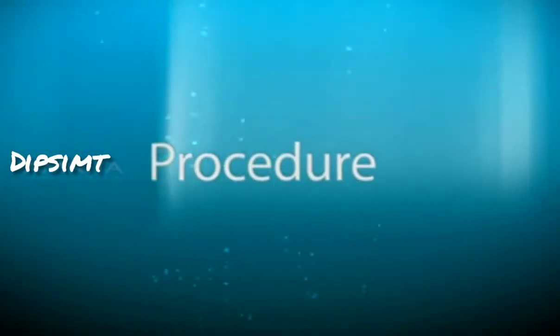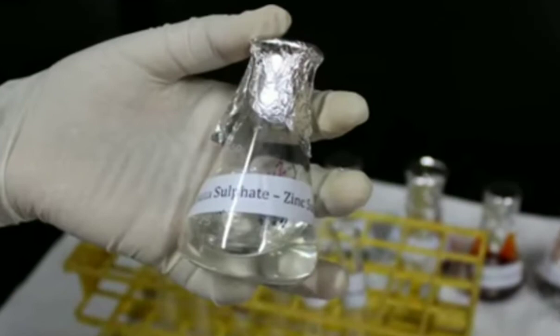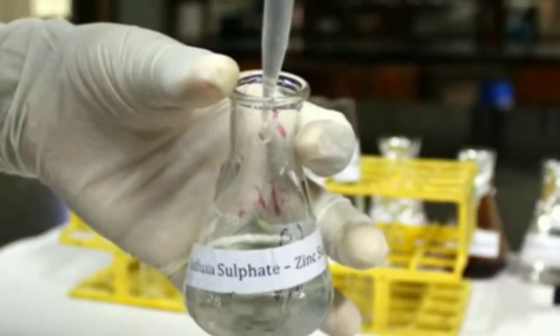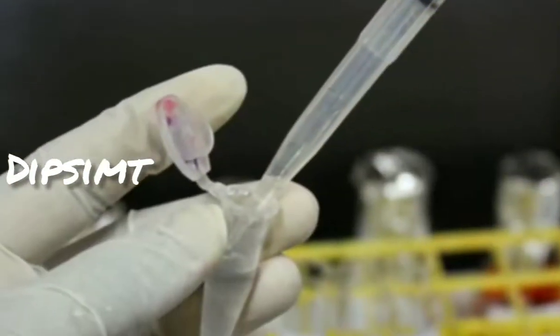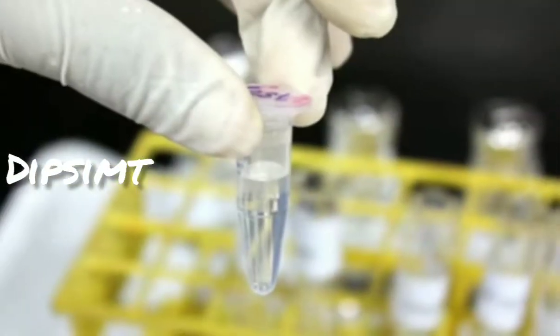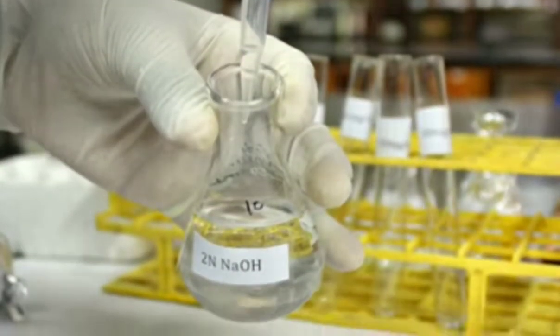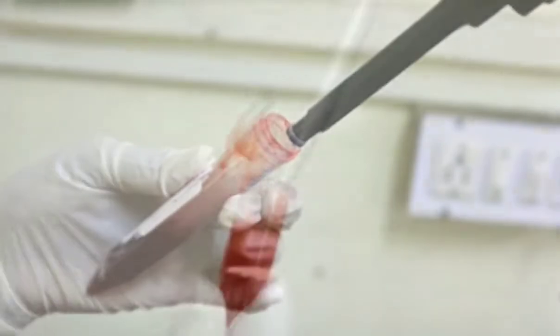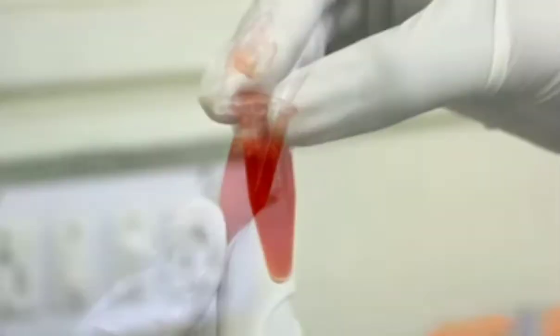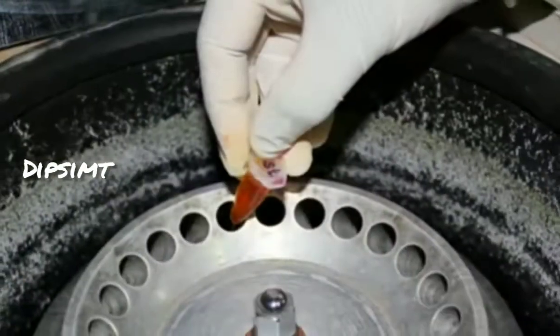Procedure: First, transfer 900 microliter of sodium sulfate zinc sulfate solution to a 1.5 ml microfuge tube, which is labeled as test. Likewise, transfer 50 microliter of 2 normal sodium hydroxide and 50 microliter of blood sample into the same microfuge tube. Now centrifuge the sample at 3000 rpm for 5 minutes.